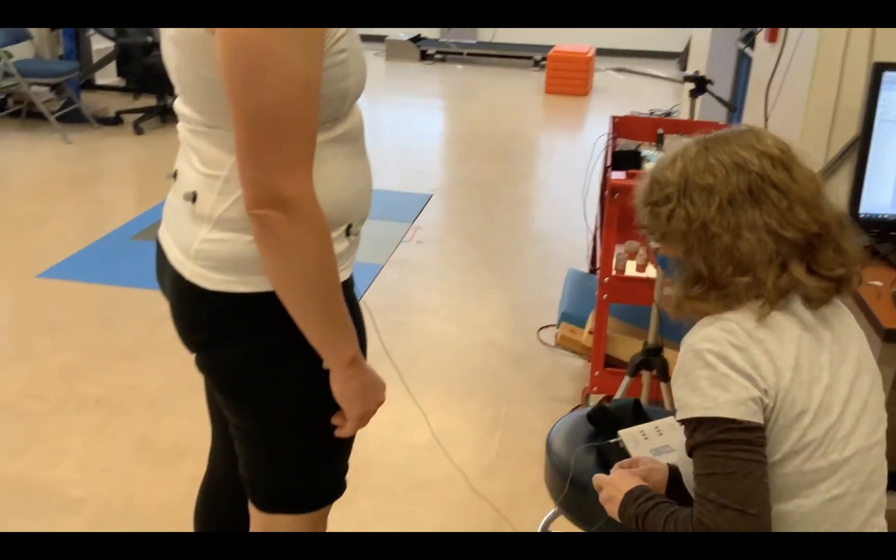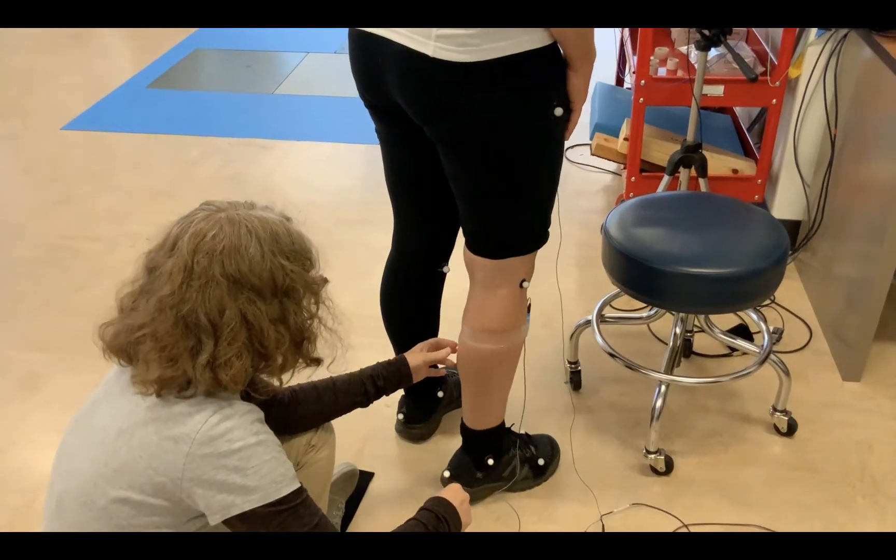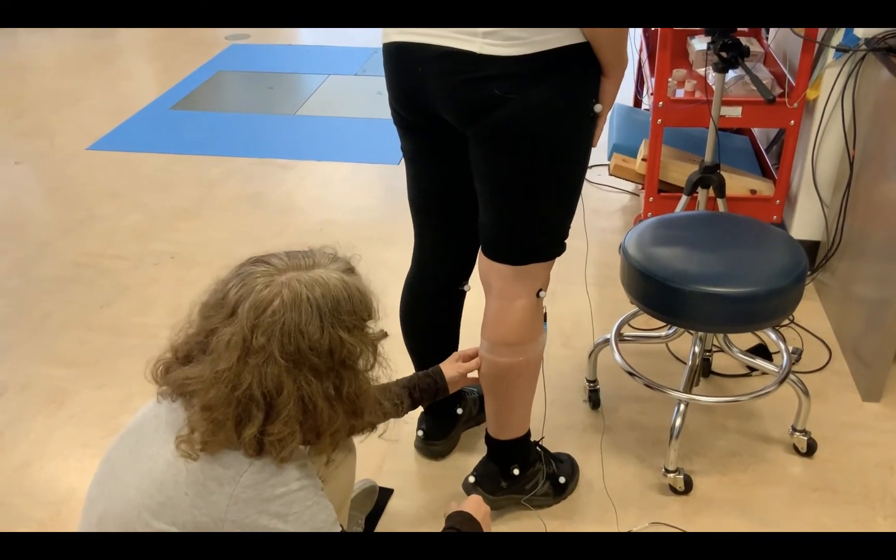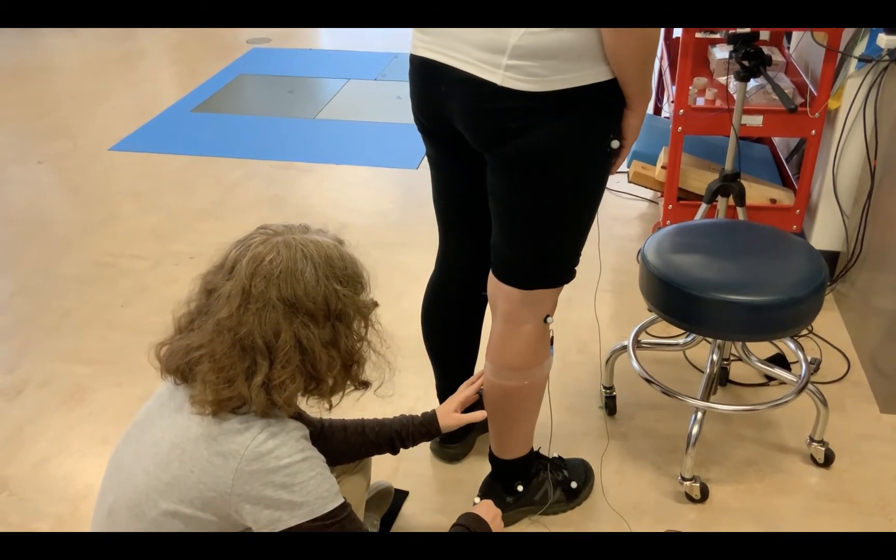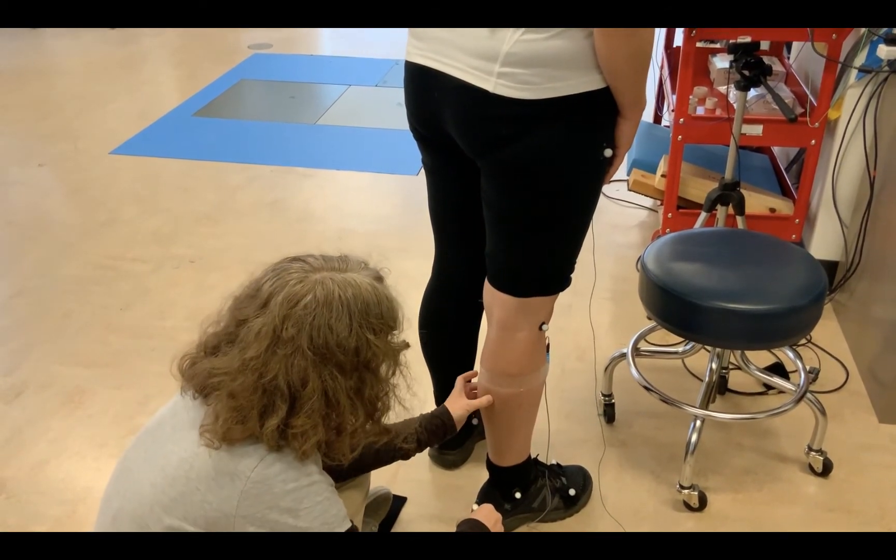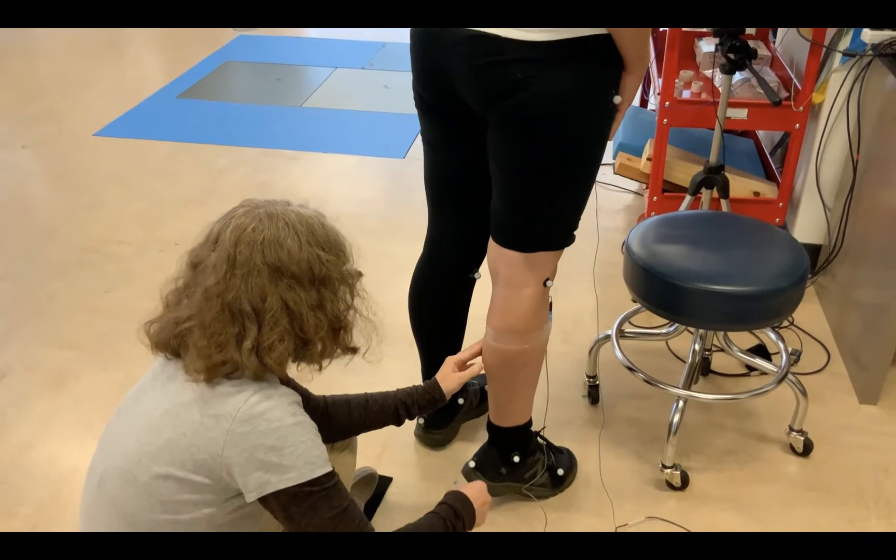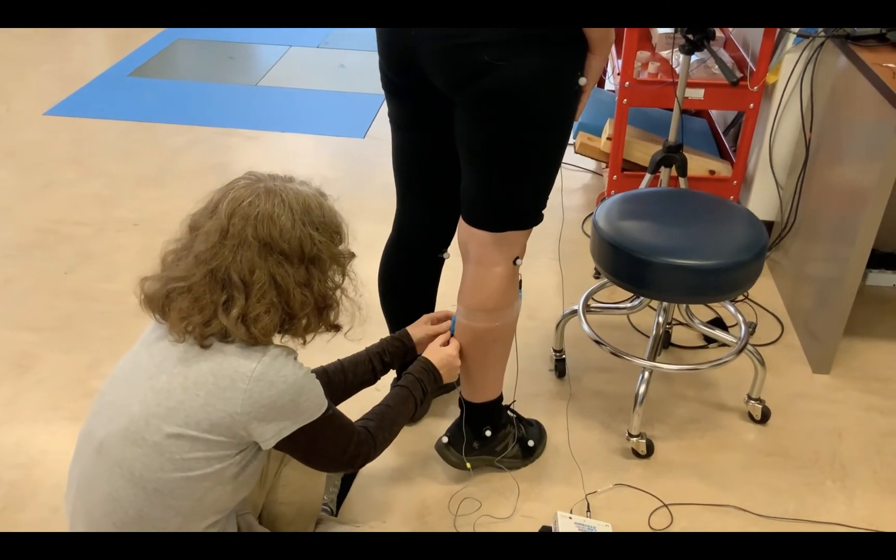If you're going to do gait analysis, two of the biggest muscles involved are the tibialis anterior and the gastrocnemius, the calf muscle. So again, the subject is doing a toe raise and the experimenter is palpating the muscle belly of the calf and placing the EMG sensor on the muscle belly of the calf.